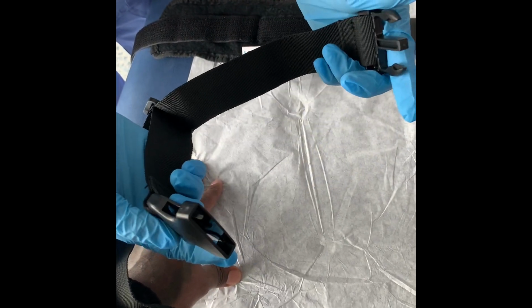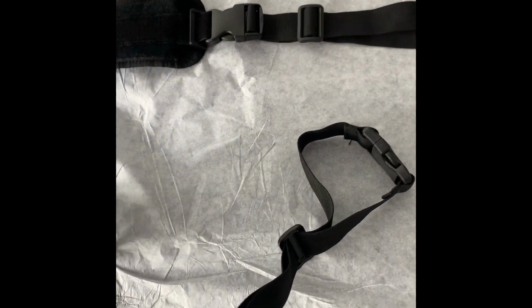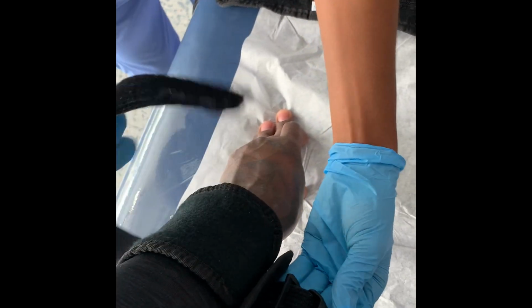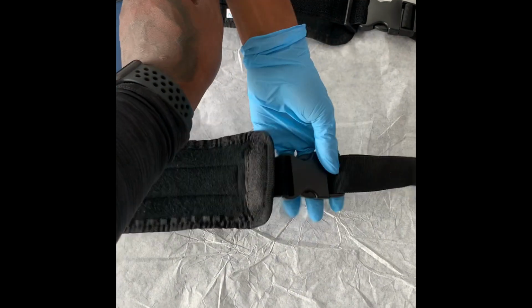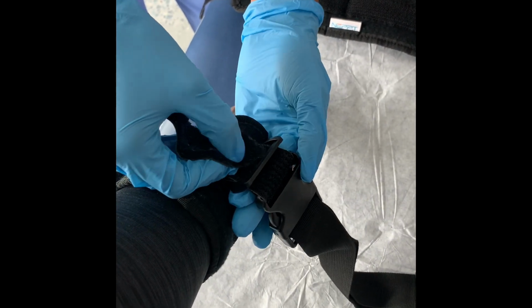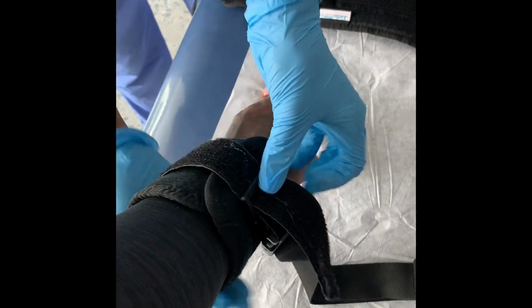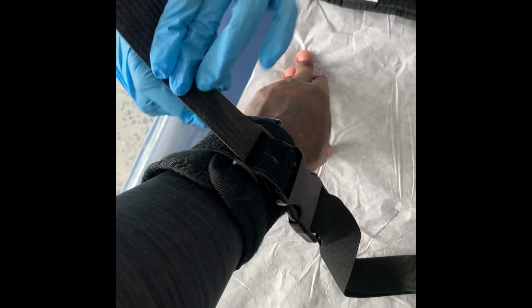It's extremely important when you come and practice your skills that you know how to use all these restraints, whatever skills you need to learn, because obviously it's all in the videos. So as you can see, soft restraints are used to prevent someone who might be confused or elderly. Like I said, this is not restraints that you'll use on a mentally ill patient. Someone who's mentally ill, you'll go ahead and use restraints that are hard, with leather ends, used by the key. So you want to use your restraints just like this.